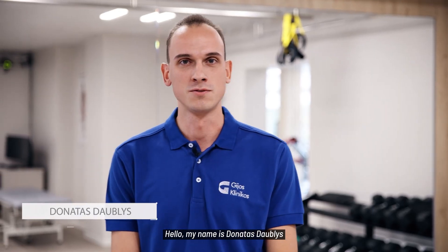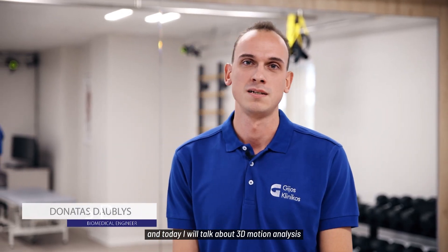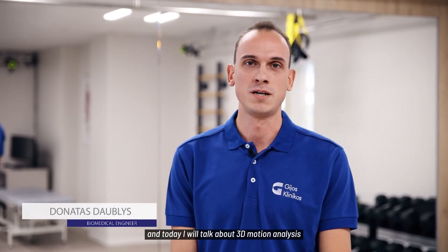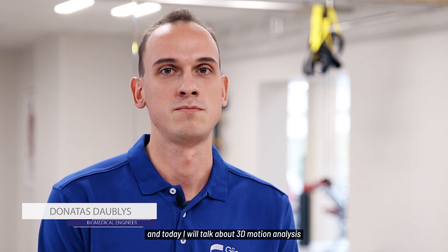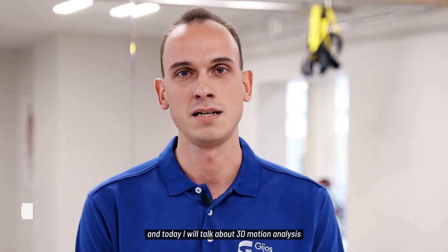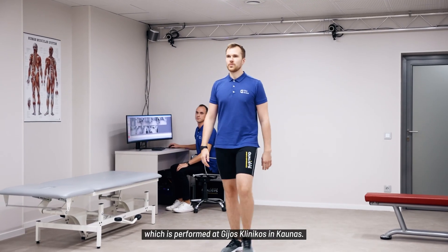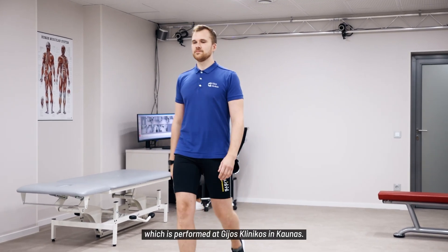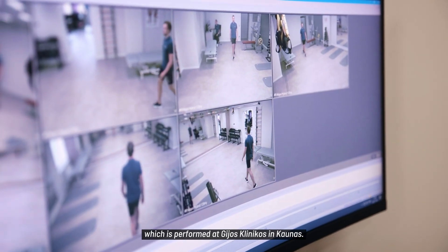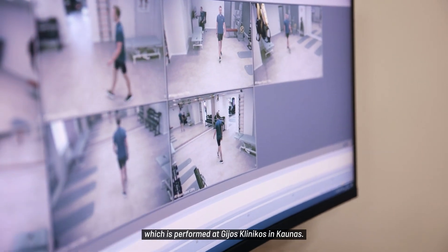Hello, my name is Donatas Daublys and today I will talk about 3D motion analysis which is performed at Gijos Klinikos in Kaunas.